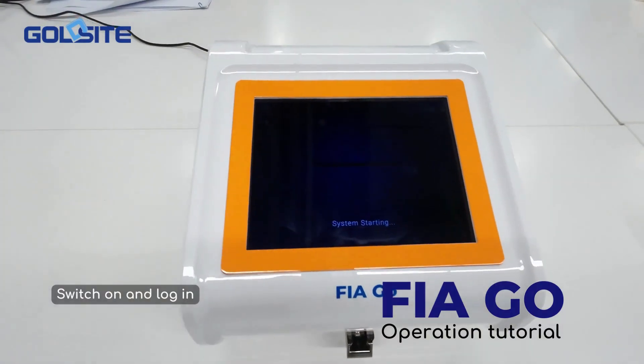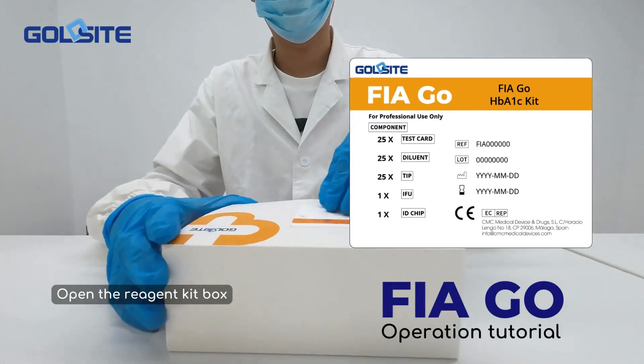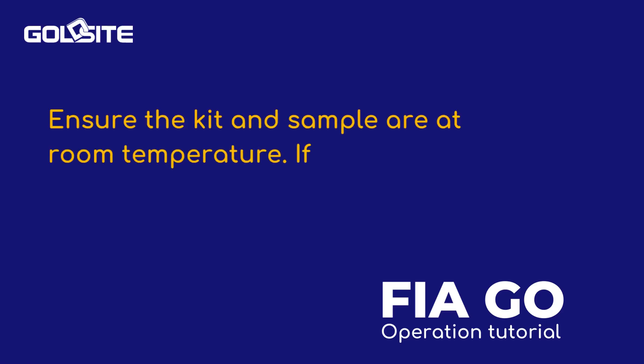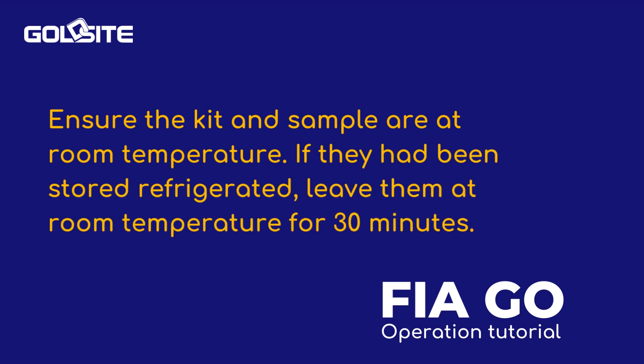Switch on and log in. Open the reagent kit box. Ensure the kit and sample are at room temperature. If they had been stored refrigerated, leave them at room temperature for 30 minutes.